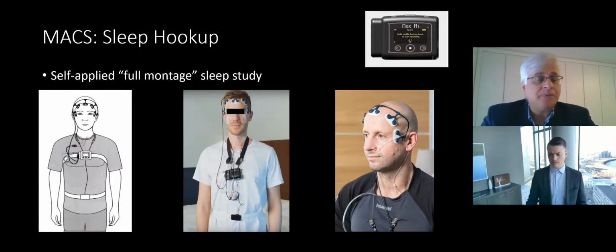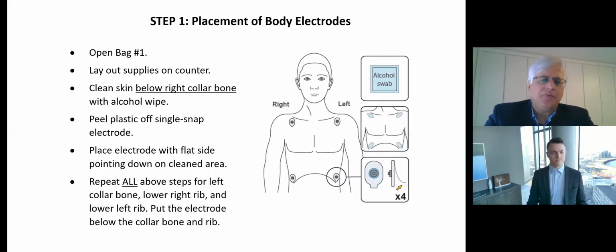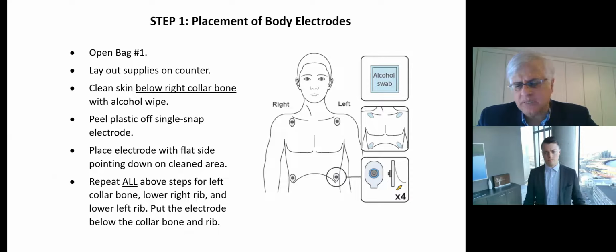And then we've also developed note cards that we insert in every packet that we give to the participants. And here are examples of what we've done from the standpoint of easing application for the participant or the patient at home. We have gone through and with help from Nox developed these note cards that are laminated and inserted in each of the participants' kit. We walk them through step by step of where the electrodes go and how to actually prepare that area.